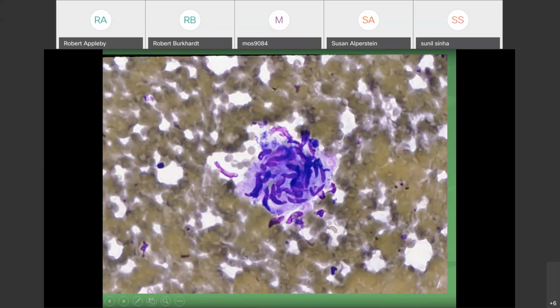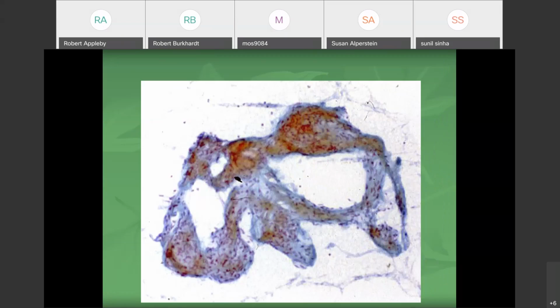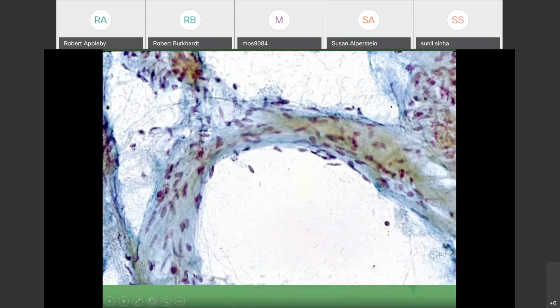This is a clue for cavernous hemangioma. And this is ultrafast Pap stain of a piece, lyse blood to show the arrangement. You see, have endothelial lining and fibroblasts.